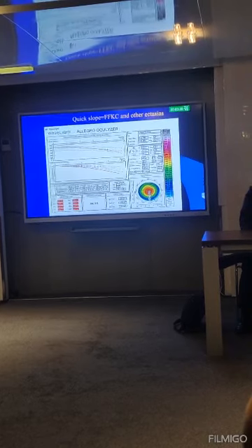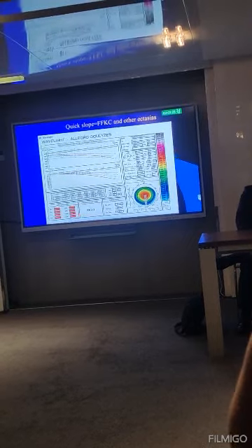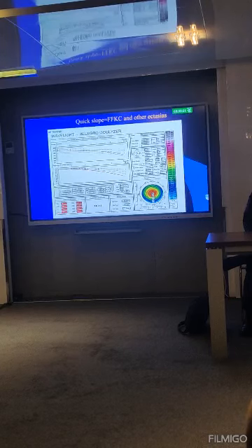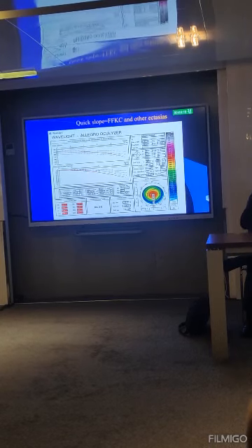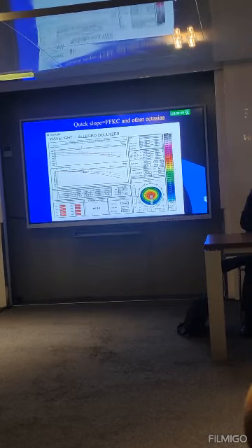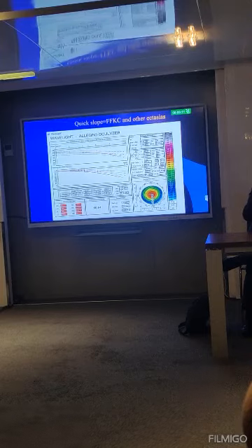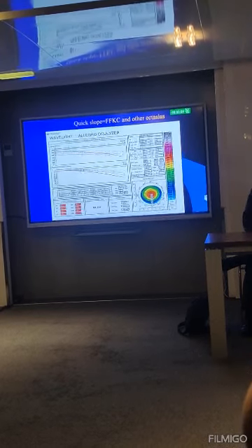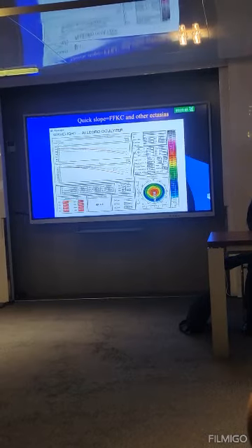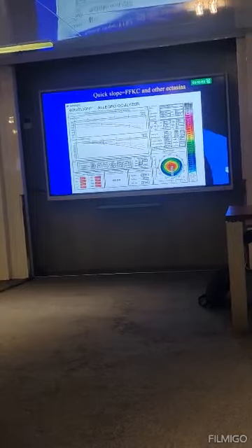The other curve is similar to the upper curve, but the difference is that it doesn't measure the average thickness, it measures the average percent of increase. Usually the change is sharper than in the upper curve. Here we look at the keratoconus level topography, it measures 2 to 3. As we said before, the Pentacam doesn't measure curvature data, and the keratoconus screening level depends here on curvature data and clinical data. But this is not very accurate, though it can give us some consideration of the case.